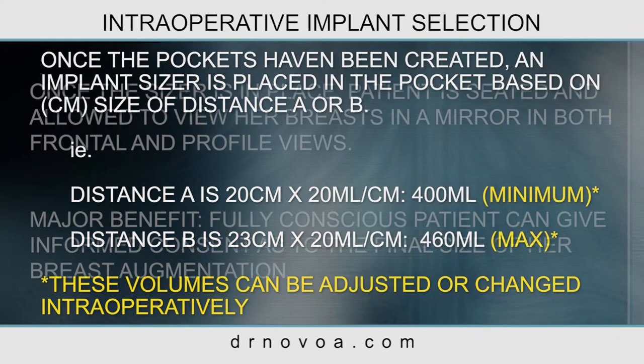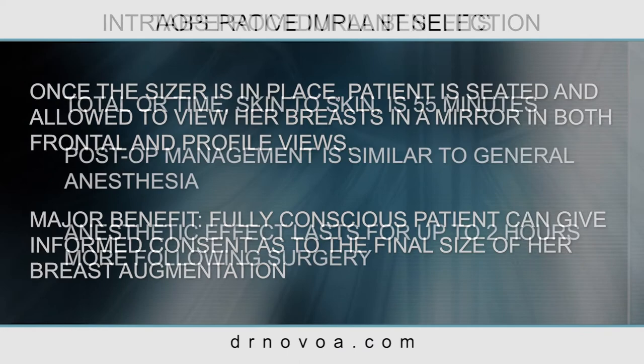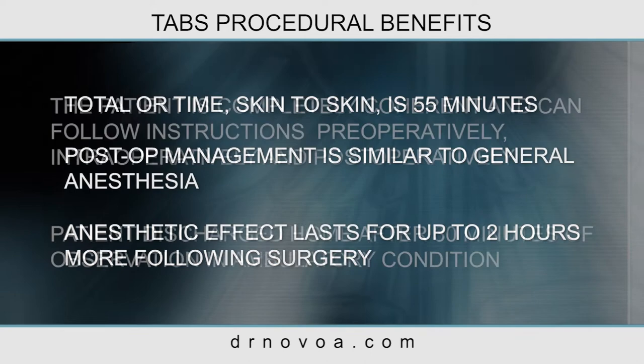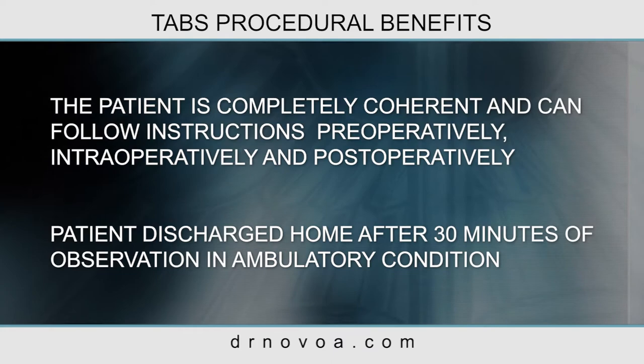Once the sizers are in place, the fully conscious patient is seated and allowed to view her breasts in the mirror in both a frontal and profile view. Total time for surgery, skin to skin, is approximately 55 minutes. The post-op management is similar to general anesthesia, and the anesthetic effect lasts for up to 2 hours following surgery. Unlike IV sedation and general anesthesia, the patient is completely coherent and fully conscious throughout her surgery, and she can be discharged home after 30 minutes of post-op observation.